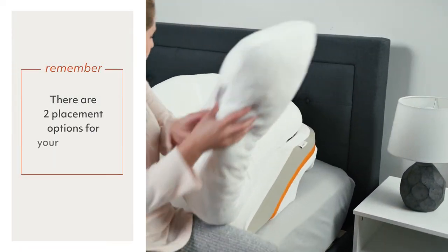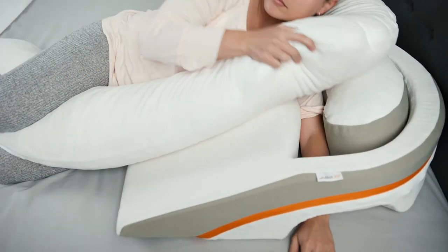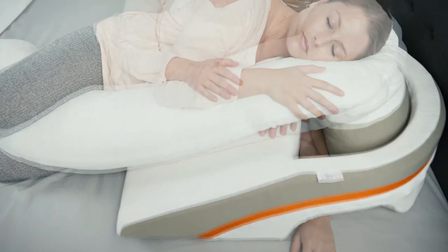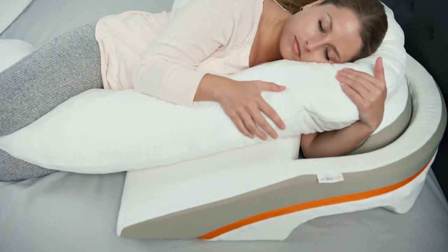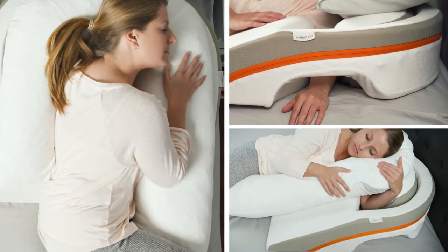There are two placement options for your lower arm. It can either be positioned down and through the lower opening, or bent and flexed upward toward the underside of the body pillow. Please try both to find which is more comfortable for you.